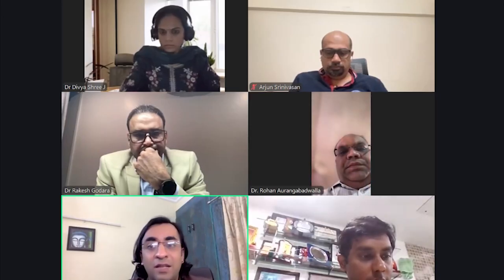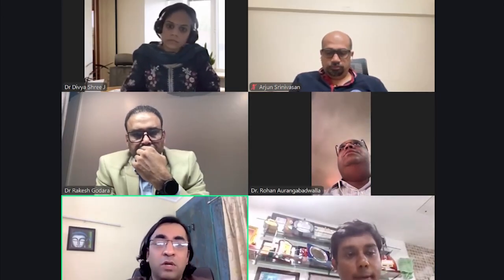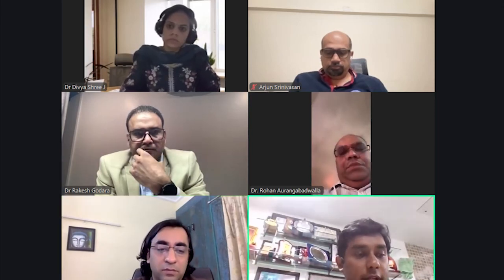First, you have to clean the vision after the bleeding settles, or after the vision is cleaned. Then only these modalities, maybe an APC or maybe a hot therapy, will work in that area. Yeah, excellent point, Dr. Saurav.